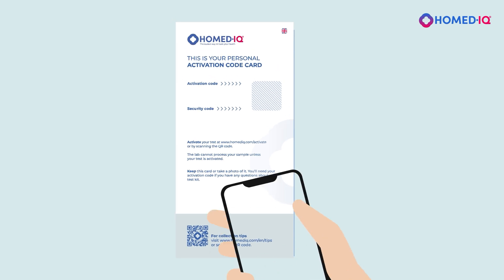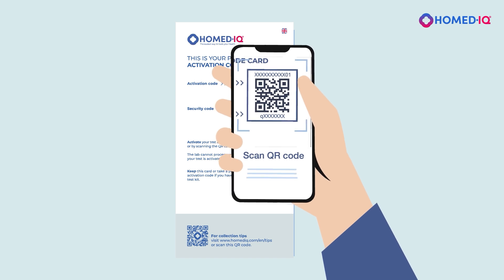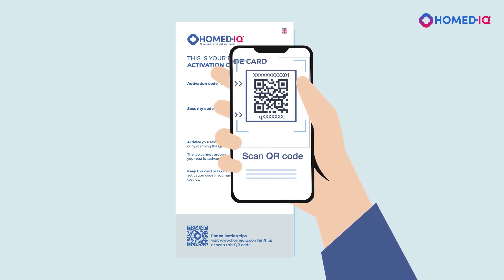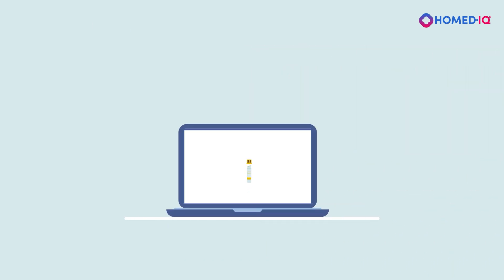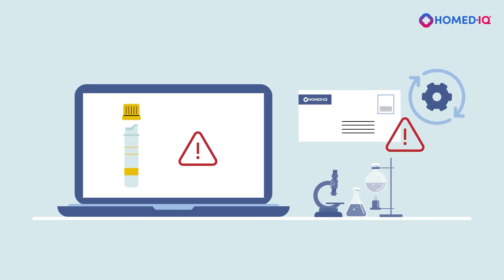Alternatively, scan the QR code on the activation card to load the test codes into the Homedic activation portal. Keep your personal activation card until you have received your test results, or take a photo of it. If you have not activated your test kit, the laboratory cannot process your sample.